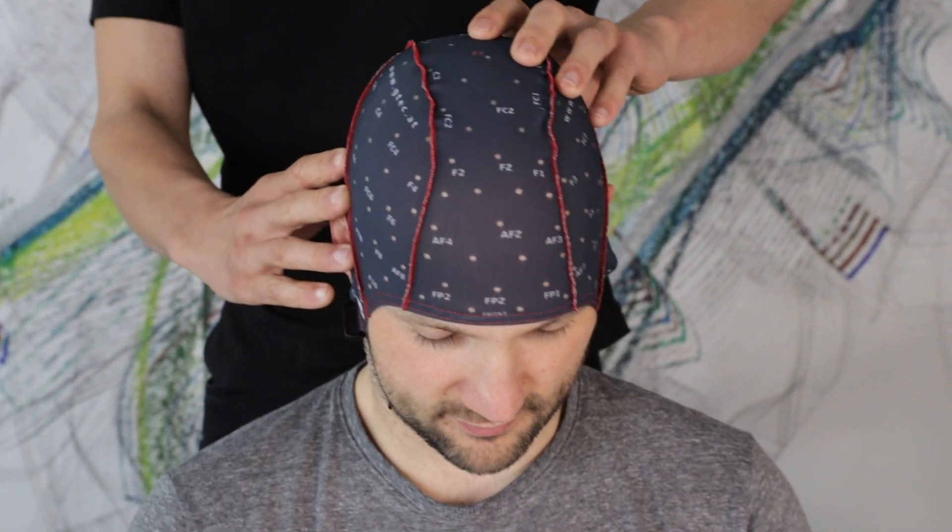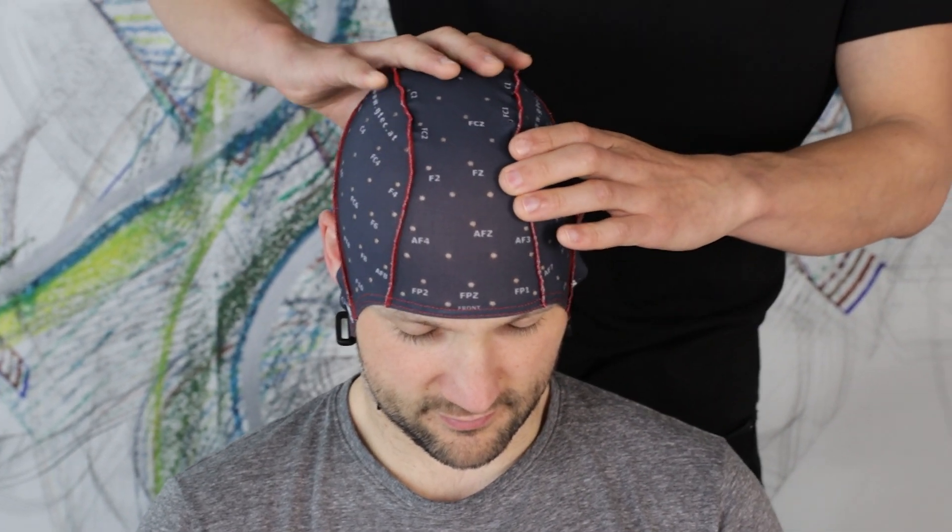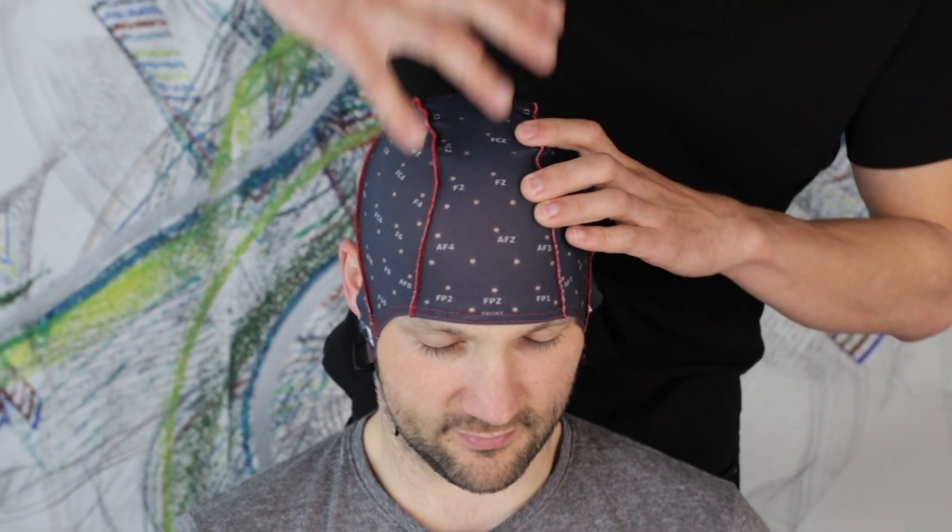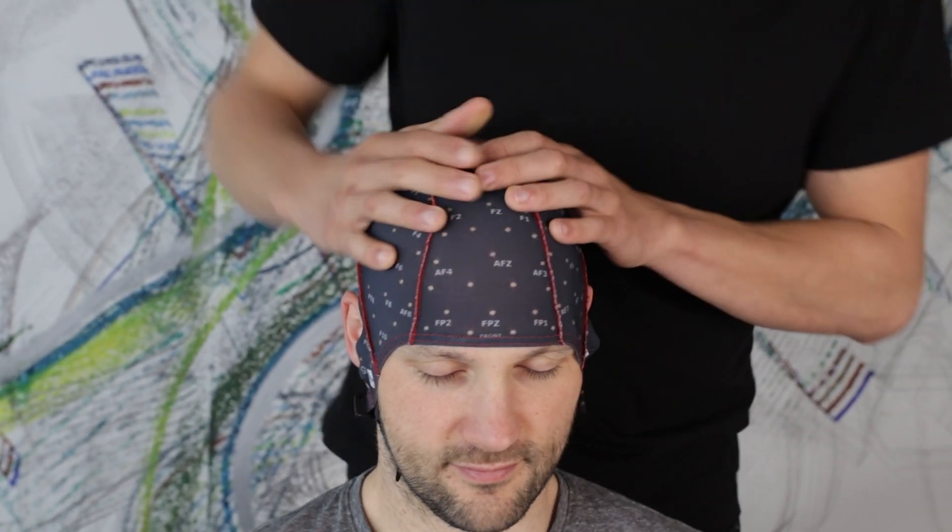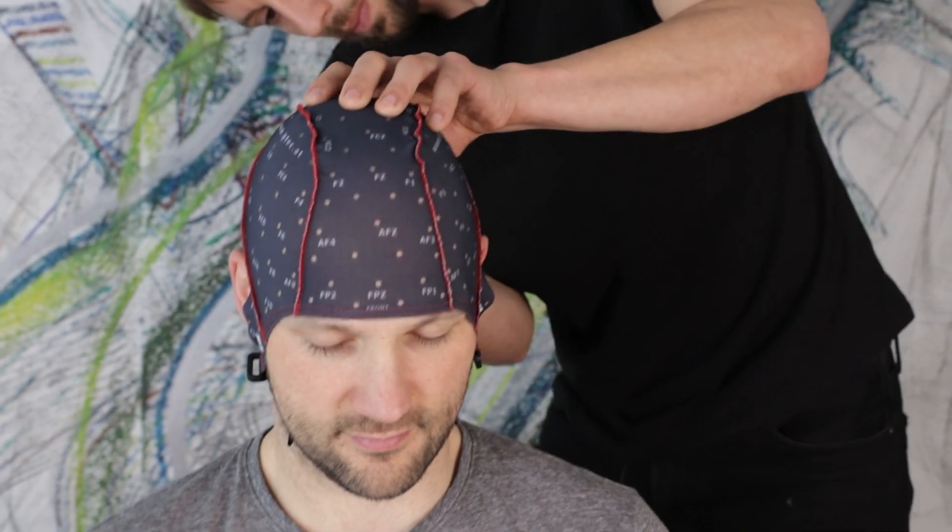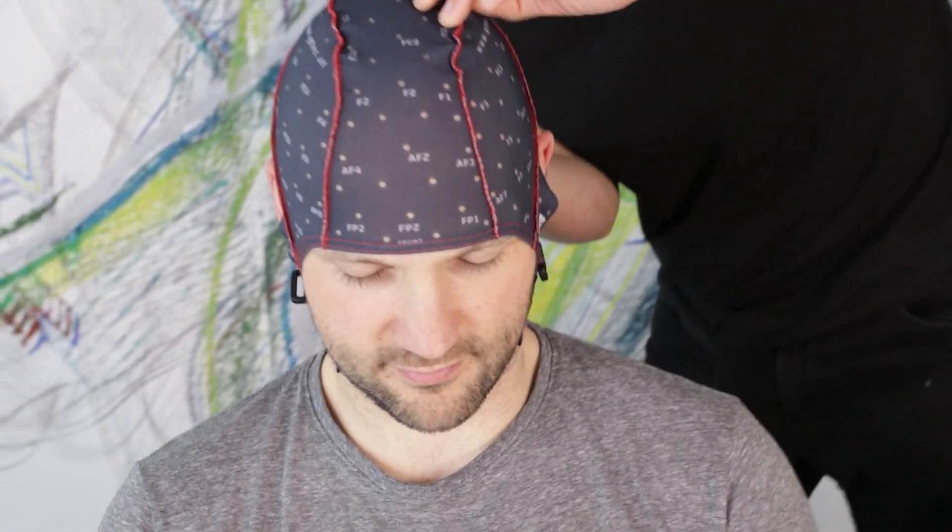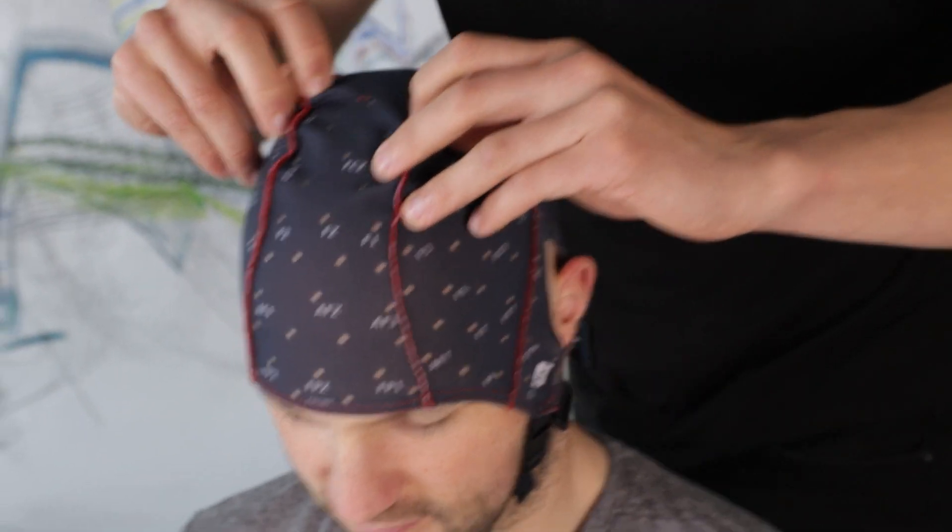So place the standard EEG cap on the head of the subject. Make sure INION and NASION have proper distance.